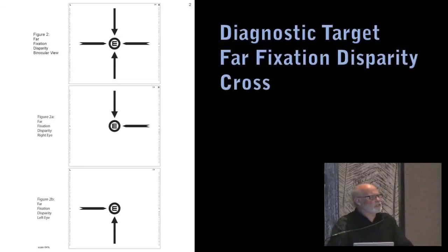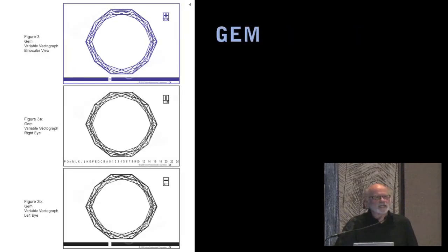This is the target I use at far, not just at far. See, if the patient starts suppressing, I shake the target to get more transient. If I shake the target, they start to break suppression. If I shake the target and they don't, I pull that far target in and I enlarge the target. So I use the bigger target. Doesn't mean I throw out the test. I got another way to test those ranges and indicate that I went to a more global, bigger target in order to decrease the suppression. I test these things at far.